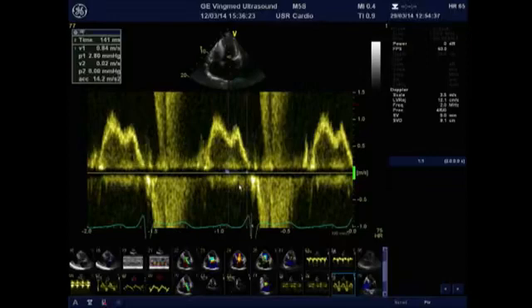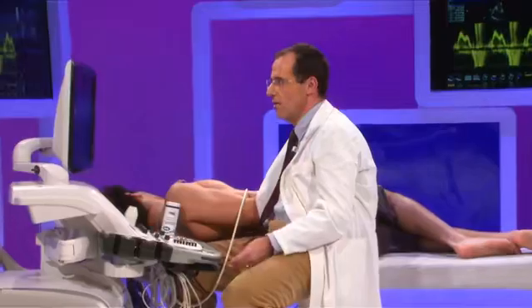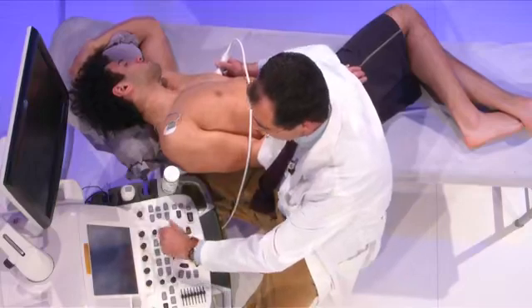the measurement of the A reversal wave in the pulmonary venous flow, and the duration of the A wave in transmitral inflow is 141. So the difference between these two parameters is 50 milliseconds. This value, when higher than 35, also points to increased left ventricular filling pressure. So this is another of the four ACVI criteria for increased filling pressures in hypertrophic cardiomyopathy patients. The other parameter pointing to this is the presence of pulmonary hypertension.